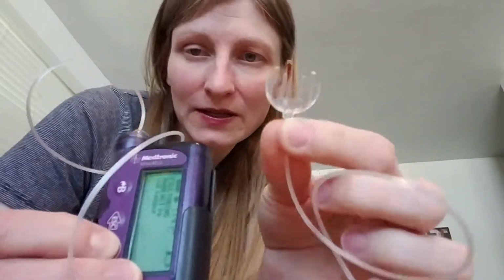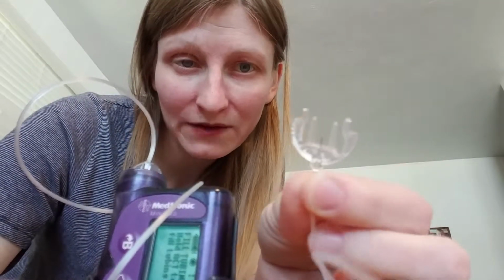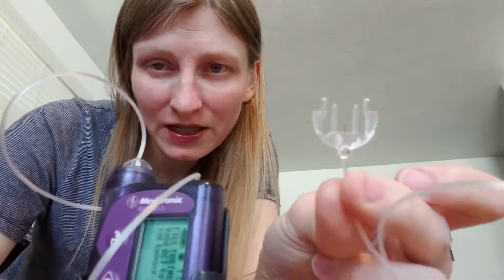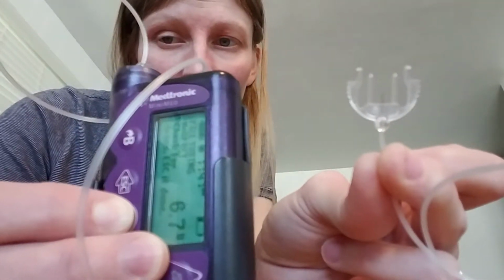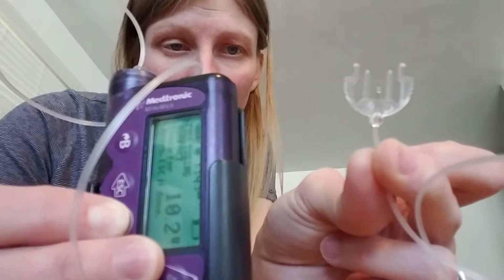So now I'm going to push down this button, and you're going to hear it start beeping, and it's going to have the motor running because the insulin is going to start going through the tubing, and I have to watch very carefully for it to come out the little needle here at the end. It's approximately 15 units, give or take a little bit. Let's see it counting. There, it's coming out. So that was 11 units. I forget always how much it is exactly. 11 units on the dot for that one. So if you had air in it, it might be a little more because you're getting the air out first and it takes longer for the insulin to actually get to the end.